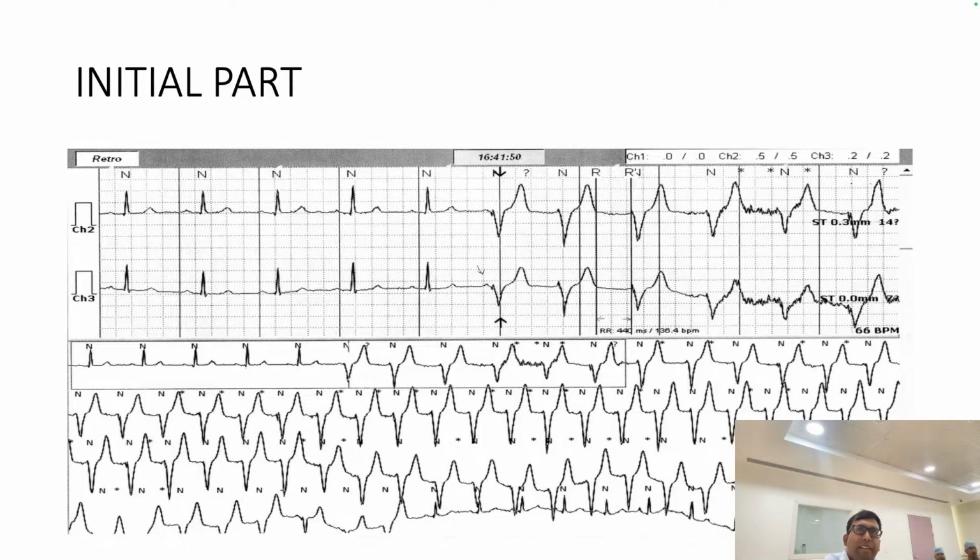Sir, it's a typical Boston Scientific strip. In Boston Scientific, there is no specific time for the capture management or the auto capture. Every 21 hours, our device will check the thresholds. Because this patient is non-dependent, when the thresholds are activated, the rate is slightly increased to 90 or 100 as required by the device. During that time, the patient is feeling the palpitation. Other times, there is no palpitation. So why is it happening for so long? Our device will start the thresholds from 3.5 until the loss of capture each and every time.